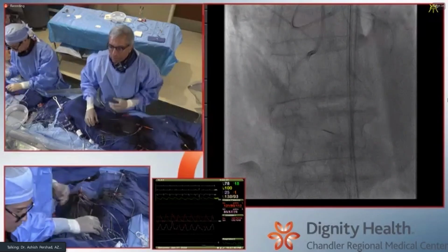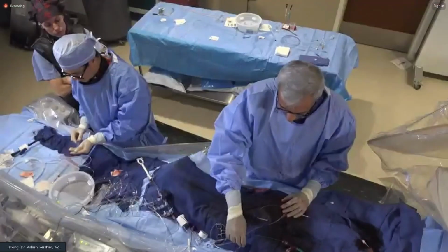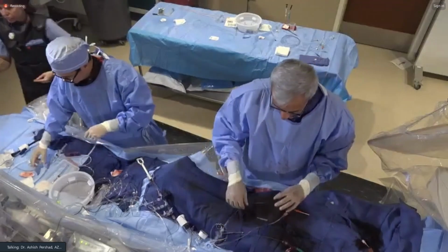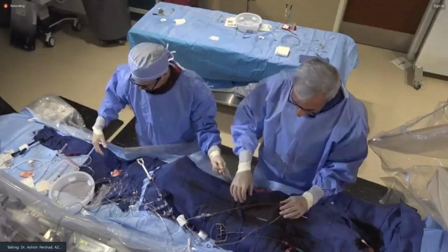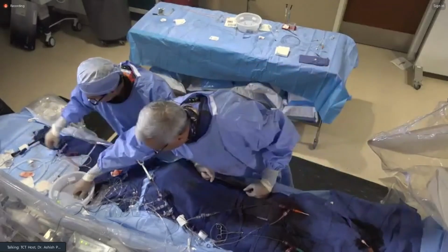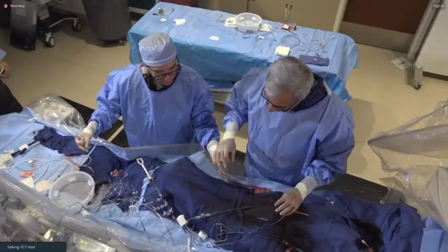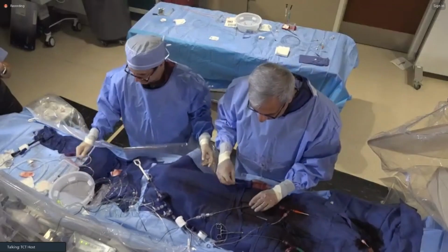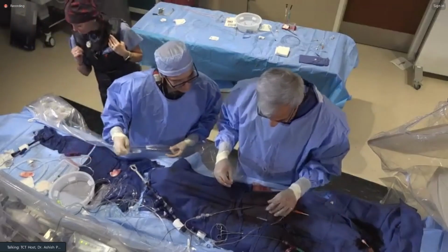All right. Nice. So we have the poor man's IVUS, not what you're going to see at Columbia with 60 megahertz and with AI-based imaging. That's okay. Are you telling us you're going to use the Volcano? Is that what you're saying? Because not even a Kiko can overcome the limitations of that device. I know.